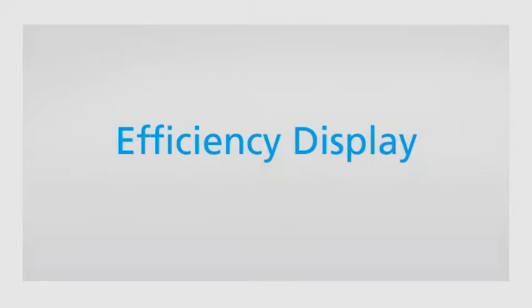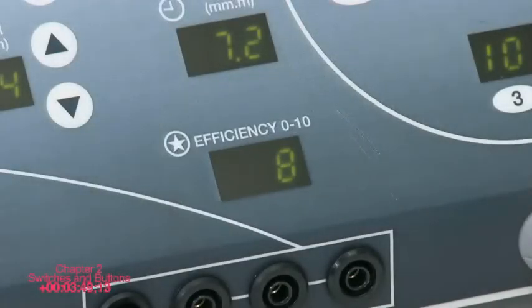Efficiency display displays the real-time efficiency value on the tissue. The display shows efficiency range of 0 to 10, 0 being lowest and 10 being the highest. If the efficiency value is 0, the RF will not be activated. When RF energy is being delivered, the desirable range of efficiency is 6 to 10, except for track ablation mode, where the acceptable efficiency range is 1 to 10.